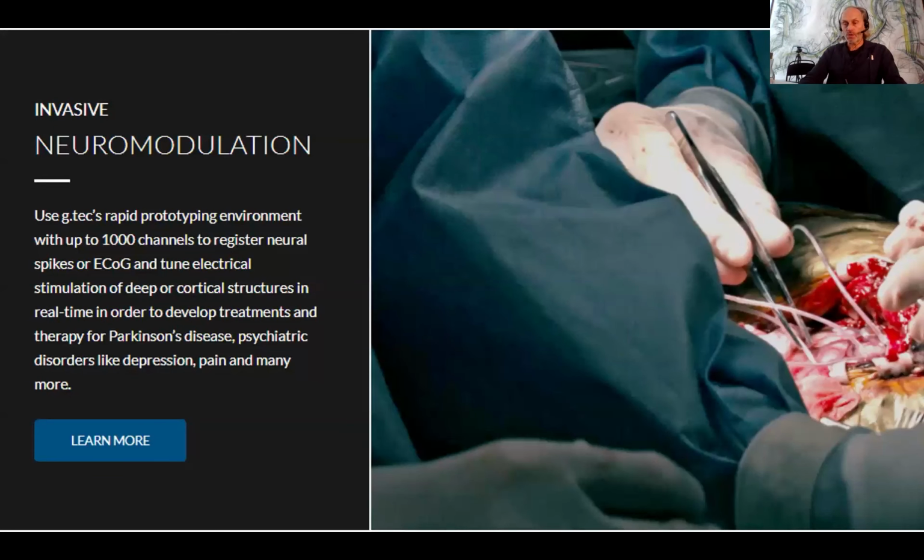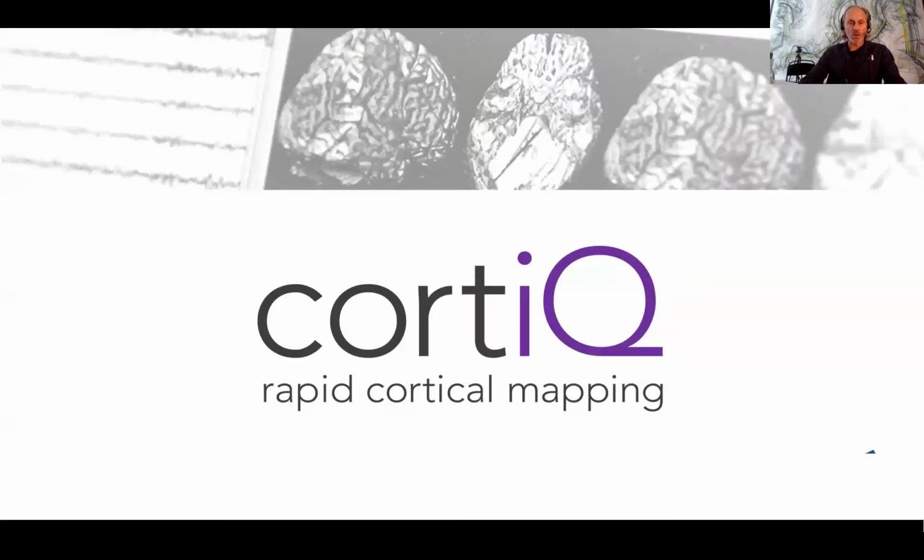And this also extends into neuromodulation. So the difference in neuromodulation is that we're also measuring from the brain. Then on demand, in real time, different brain regions are stimulated. So this can be, for example, the thalamus in Parkinson's disease patients.